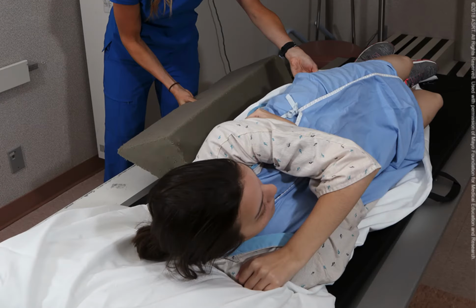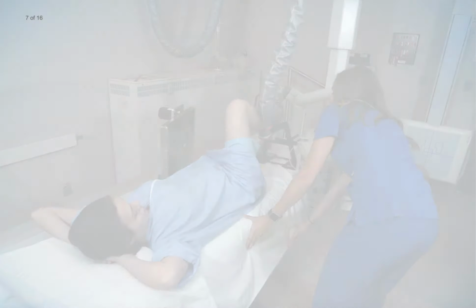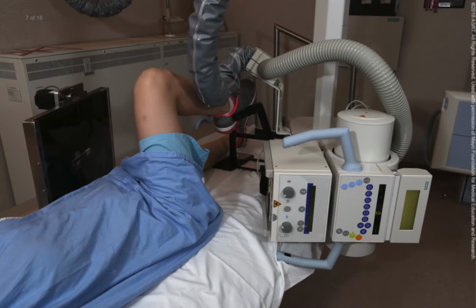When elevating the pelvis, make sure the positioning cushion does not extend past the lateral aspect of the hip so that it will not impede positioning of the image receptor. Place additional cushions under the affected limb for support. To raise the unaffected leg out of the field of view, have the patient flex the unaffected hip and knee until the thigh is nearly vertical, then rest the foot or lower leg on an appropriate support device. Make sure the device does not interfere with the path of the X-ray beam, but do not use the X-ray tube housing or collimator for support.